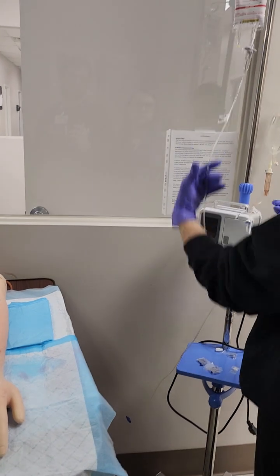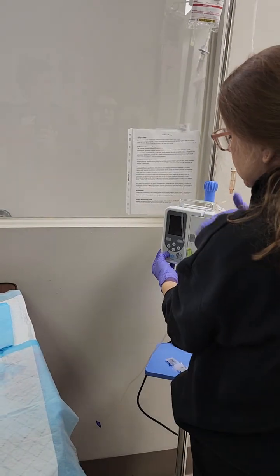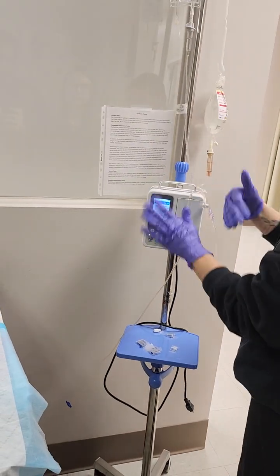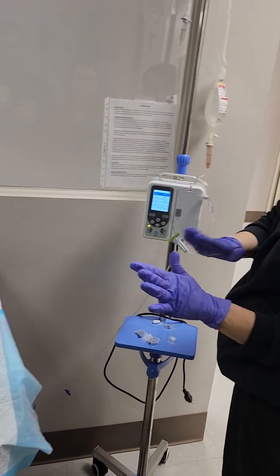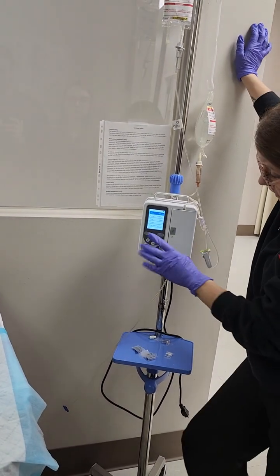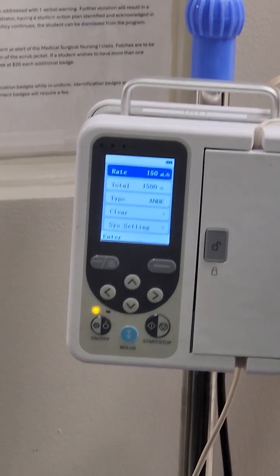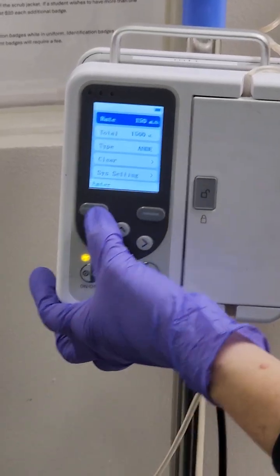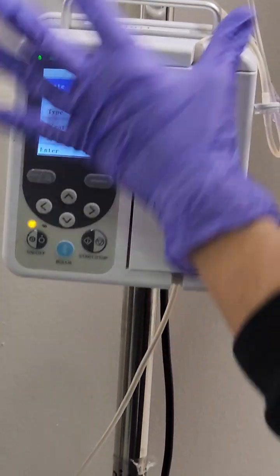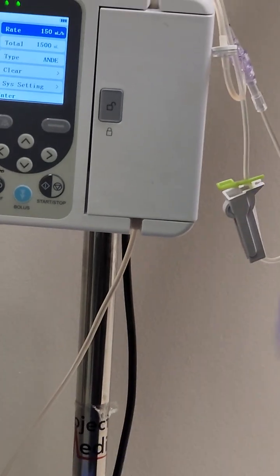I clamped it, so what do I have to do? Unclamp. My pump would be on and on hold, but it would start beeping, so I'm not going to do that. So I'm going to go into my secondary function, because this is my primary and it's infusing at 100 an hour. I need to set my secondary. When I go in, the previous rate was set for 150. So what did we calculate our rate to be? 100. I'm not too concerned about you all learning how to use this pump, because they're all different. But every pump, you have to have a rate and you have to have a volume. That's all you need to know.